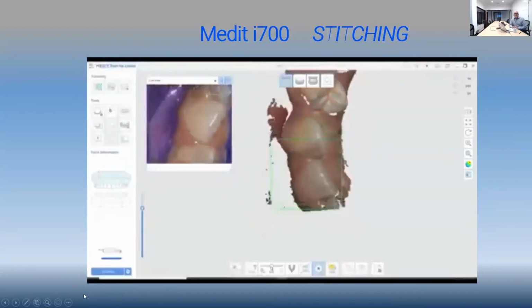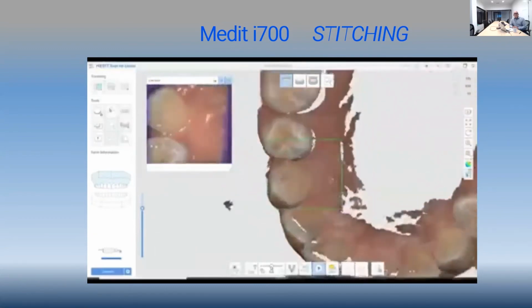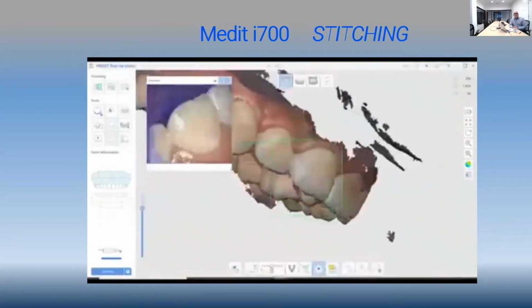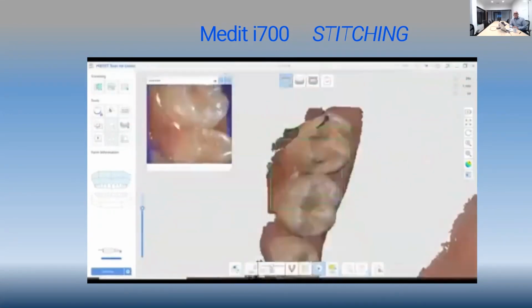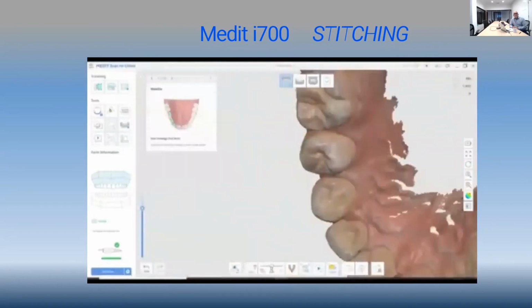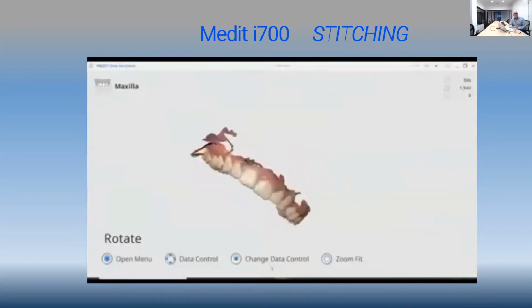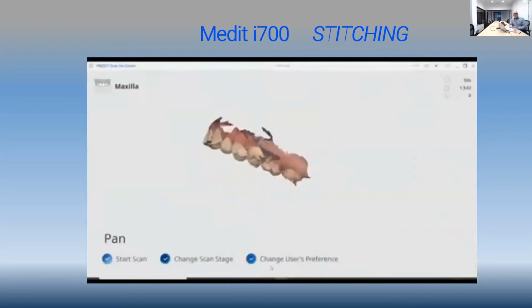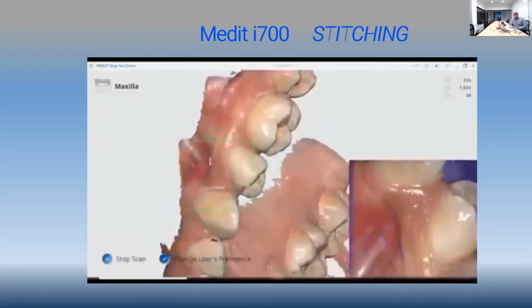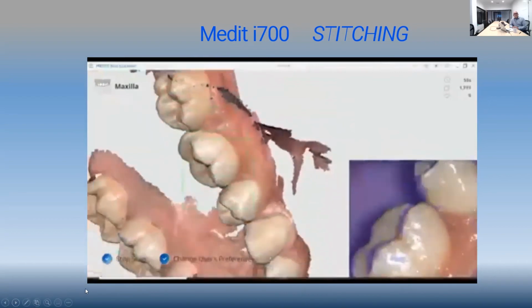So we're scanning a full upper arch here. And those of you who have scanners, watch how fast this is picking up all the details, going back and forth a little bit. So the dentist is going through the whole thing. And at the very end, when he gets the whole scan, he's going to take a good look at it and move it around like this and see if there are any little voids. And if there is anything, boom, he goes right back to it. If there was a finger in the way or a tongue in the way, whatever it would be. And this is all being done with that little remote control thing that Brian was just talking about.